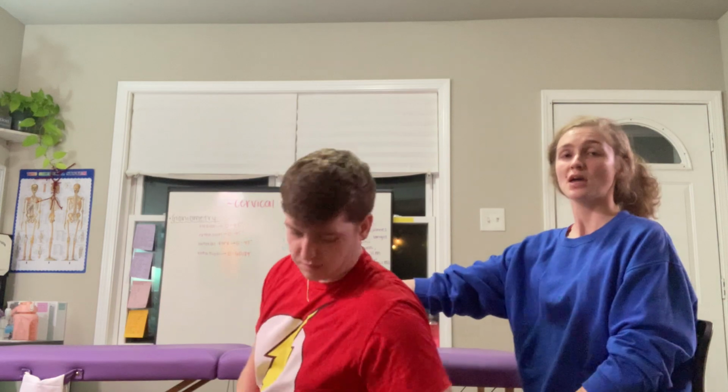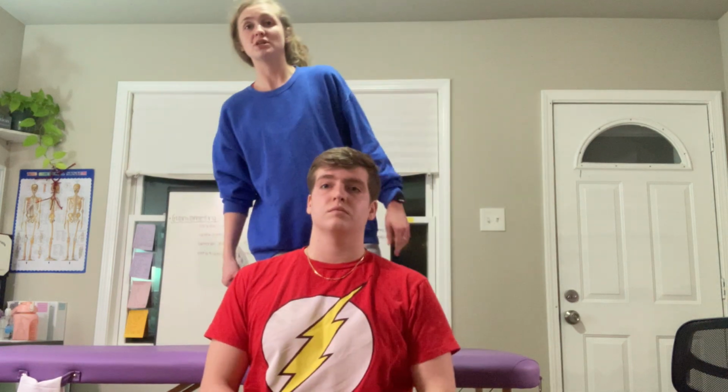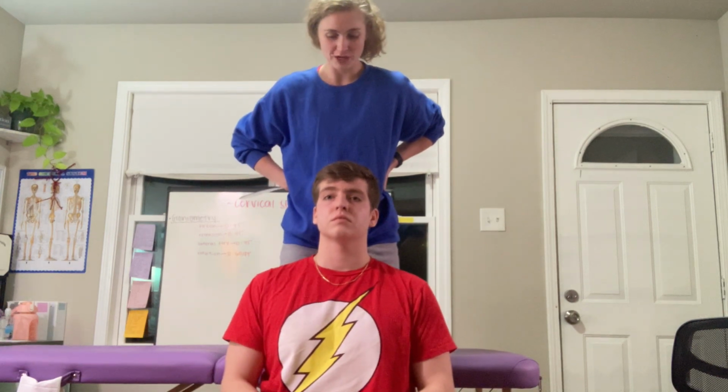So the last measurement that we will be taking today, we will have Nick face the camera, and I'm going to sit on the table behind him. Kneel, actually. In order for this measurement to be valid and reliable, you need to be able to see the top of the patient's head at the exact top. You cannot be slightly underneath, or else your measurements will not come out correctly.